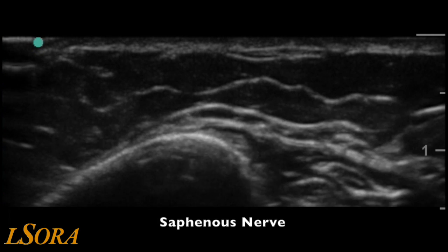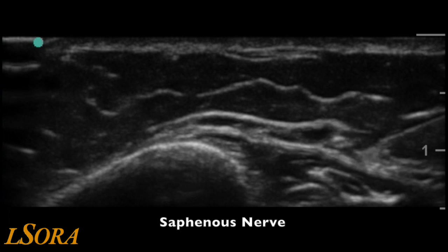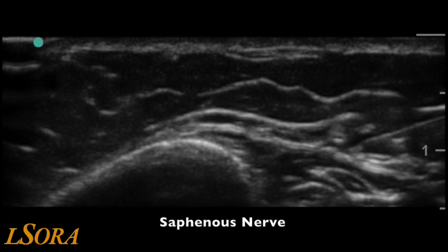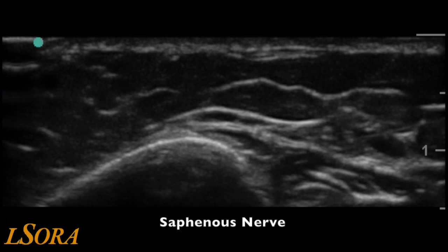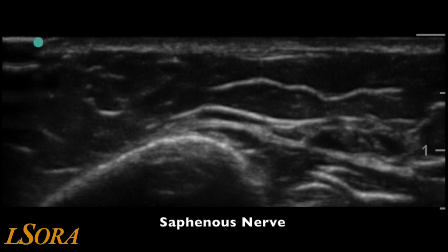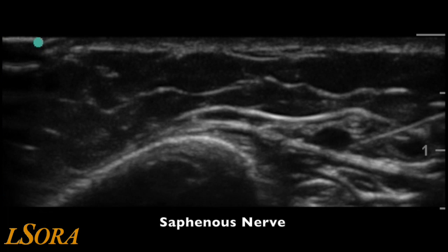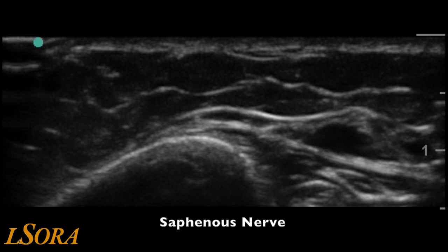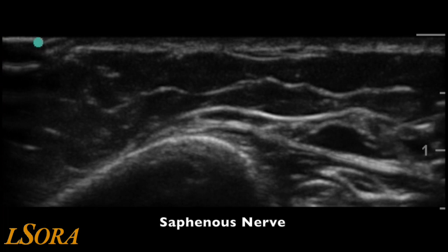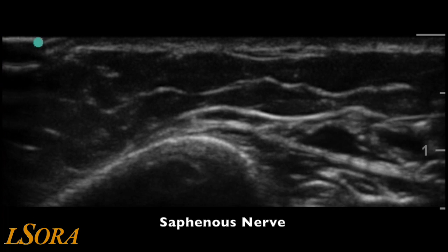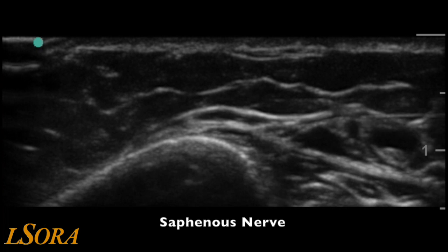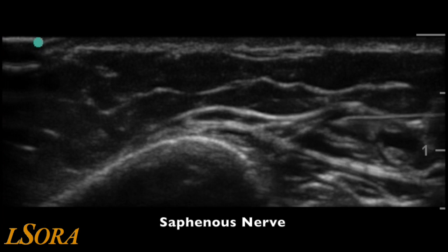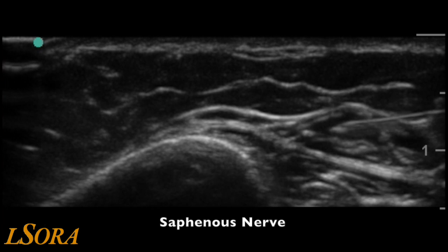In this video of a saphenous nerve block, the needle is introduced from the right-hand side of the screen. You can identify the saphenous vein, and as the local anaesthetic is administered to the right-hand side of the vein, the hyperechoic, very small saphenous nerve is identified.